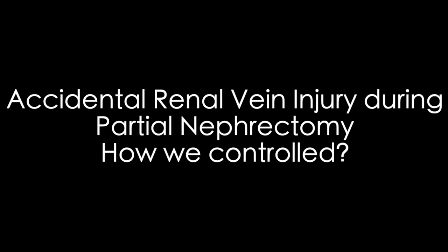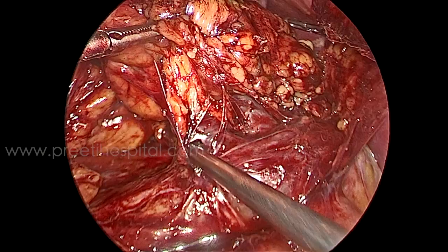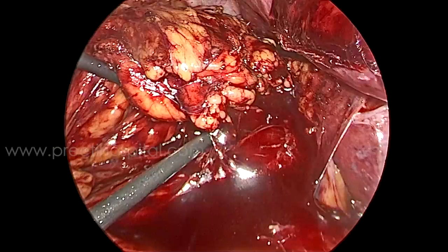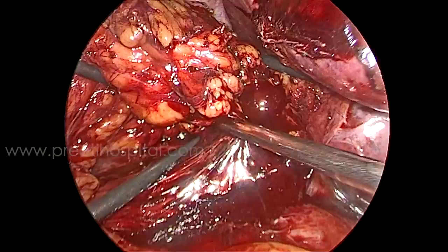Here is a case of accidental renal vein injury during partial nephrectomy and how we controlled it. Any venous bleeding is dangerous. I was dissecting the fat with the suction and there were two big veins of the same caliber. The tip of the harmonic touched the vein and perforated it — just a touch — because the vein is very thin. These accidents are never expected, and this is an unedited video.